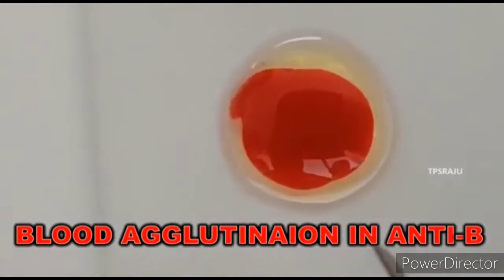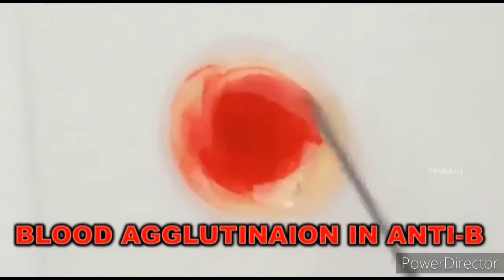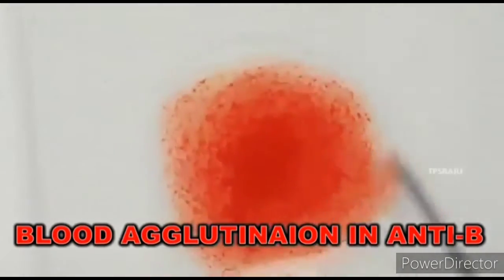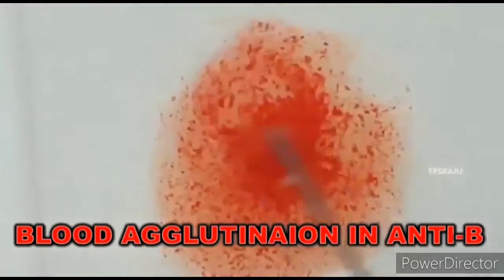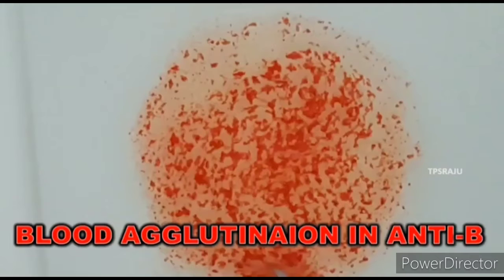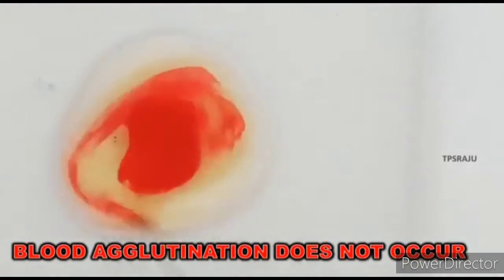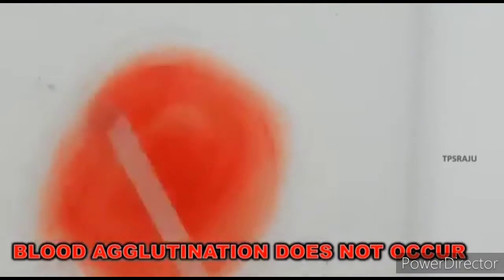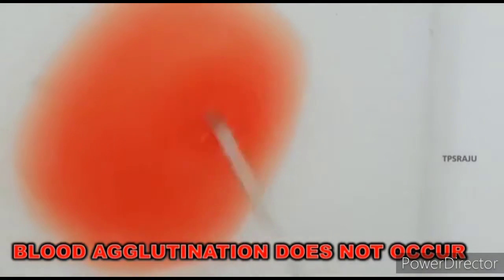If the serum agglutinates the blood drop, then we know that it is blood group B. If it is not agglutinating the blood drop, then it does not belong to blood group B. So, like this, we have to recognize blood groups A and B.